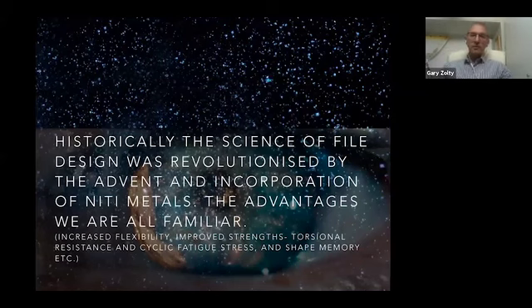Historically, the science of the file design was revolutionized by the advent and incorporation of nickel-titanium metals. The advantages, we are all familiar with. That gives increased flexibility, improved strength, torsional resistance, and cyclic fatigue stress, and shape memory, etc.